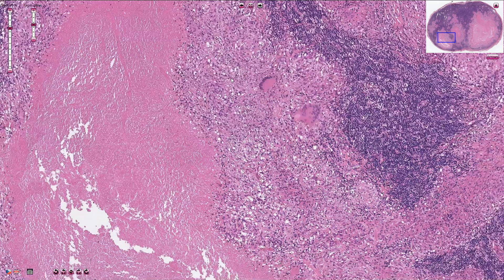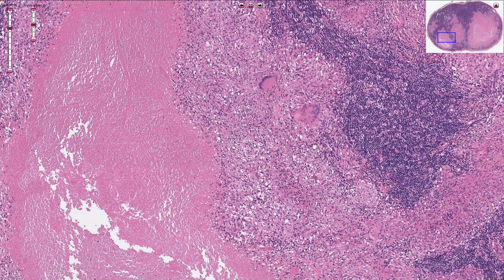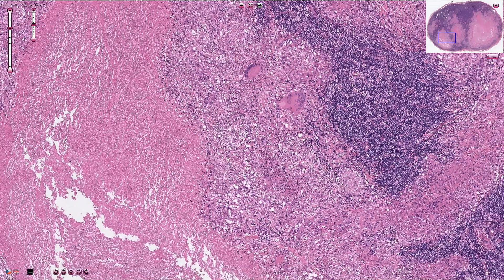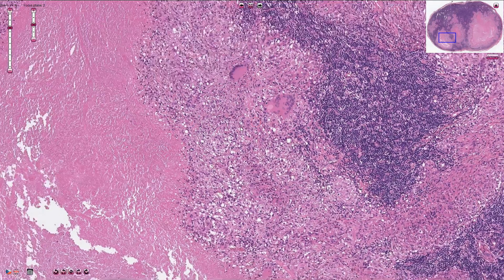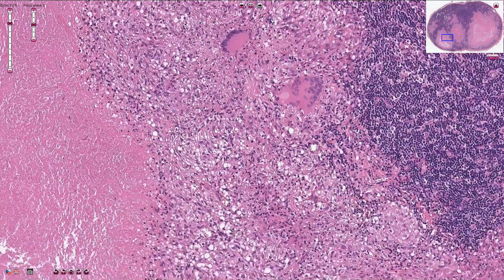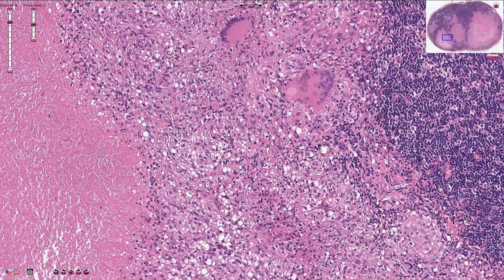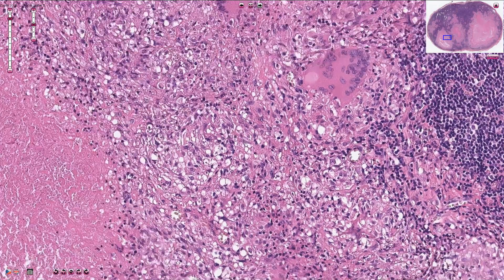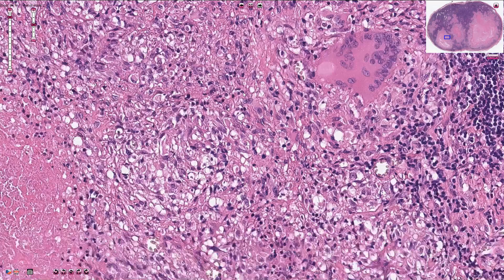Around the caseous necrosis we can see the rim made out of epithelioid cells, which is the hallmark of granulomatous inflammation. Epithelioid cells are large cells with ill-defined cytoplasmic borders containing eosinophilic and large pale ovoid or oval-shaped nuclei. So all of these cells here are epithelioid cells.